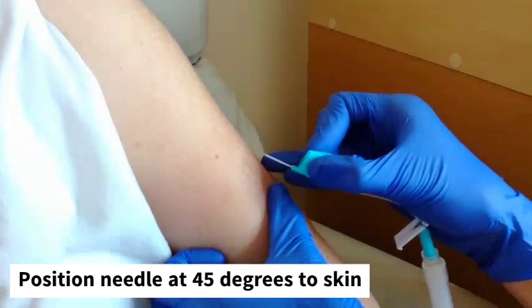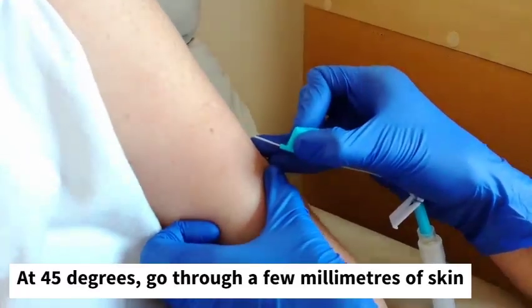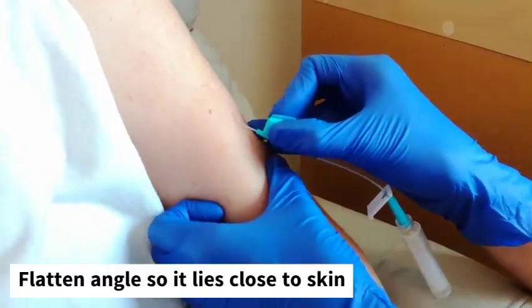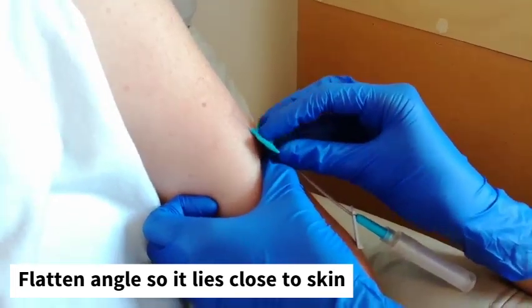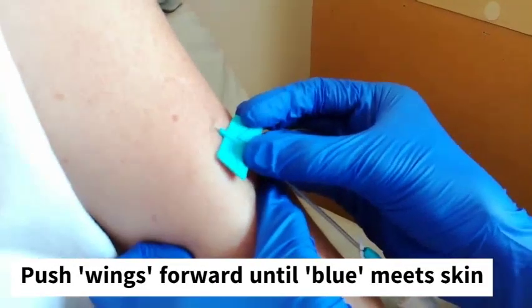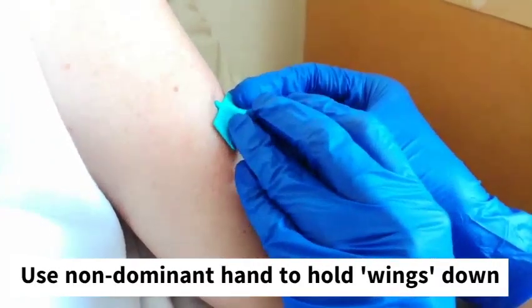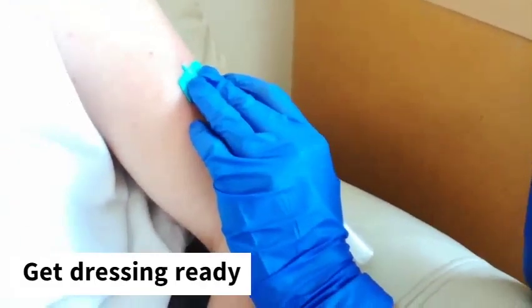We're going to start off at a 45 degree angle and go in a few millimetres. Then we flatten out the needle so that it's lying closer to the skin, and we push forward until the blue reaches the skin. Then we use our non-dominant hand to hold the wings down and to secure and keep it in place.